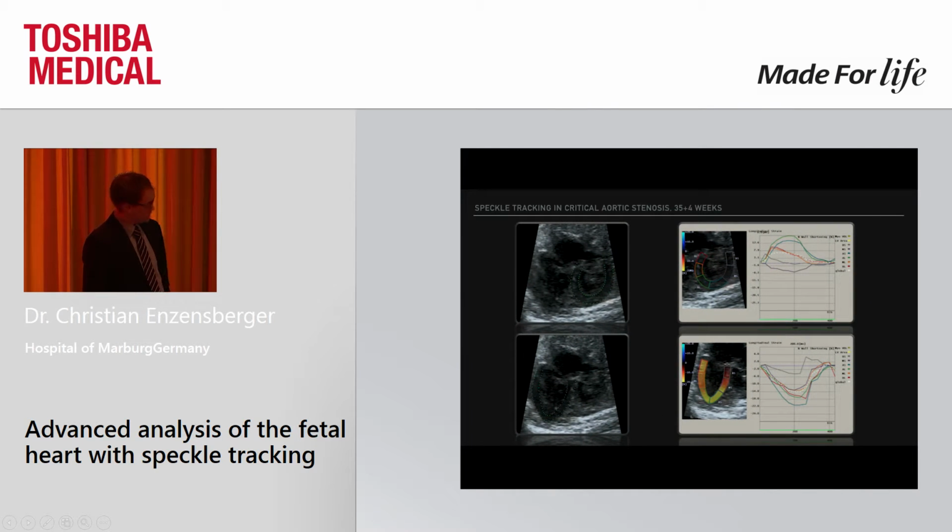Now, away from the animal model, back to the human fetus. This is a critical aortic stenosis in the third trimester, and we did our analysis on the left and the right ventricle.